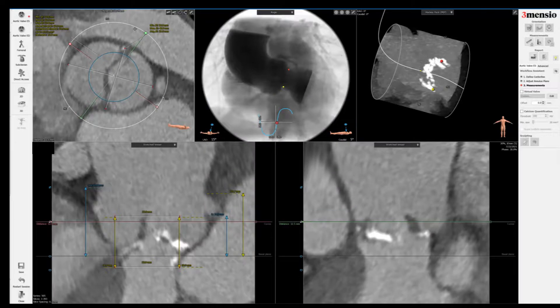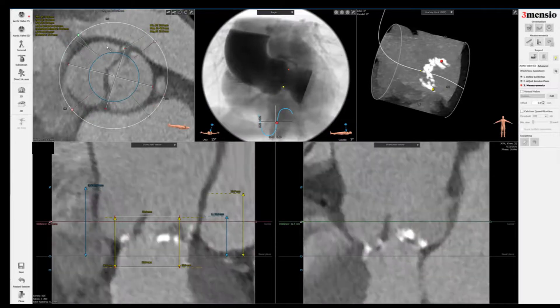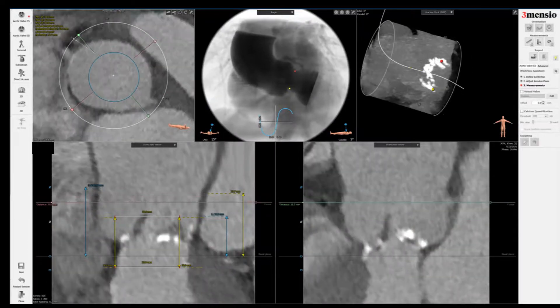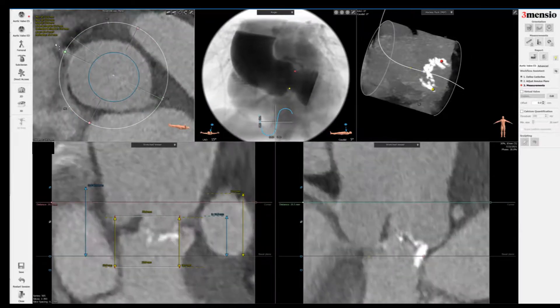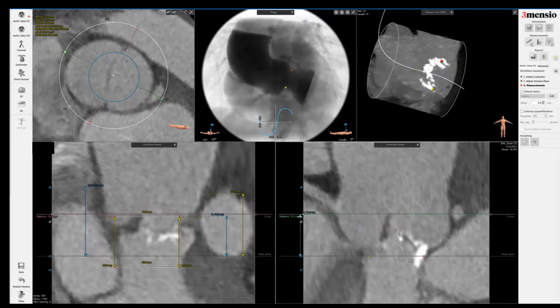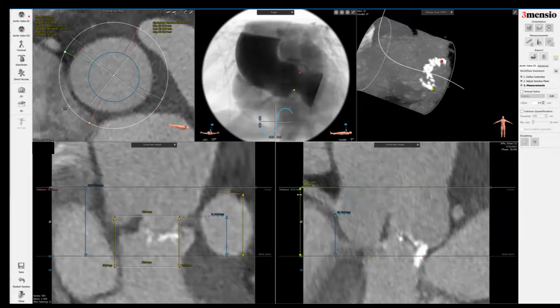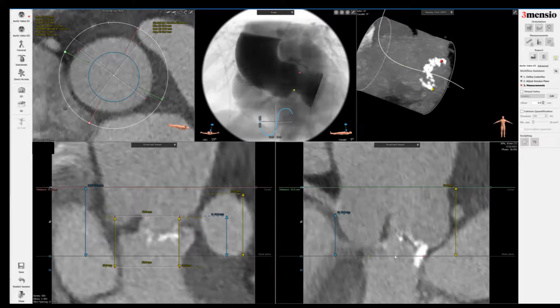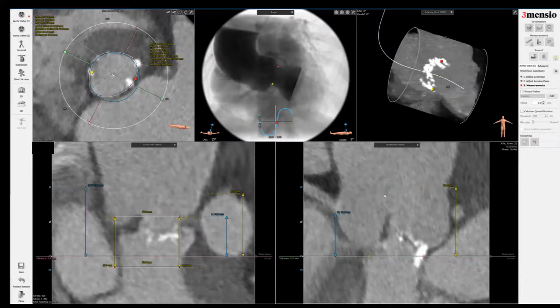I bring the green solid dot over to the left corner. You can see that type zero bicuspid typically has almost 180-degree coronary distribution. I put the right coronary height here — this is the right sinus height measured from the baseline, which is the right coronary height. I'll take a picture here.